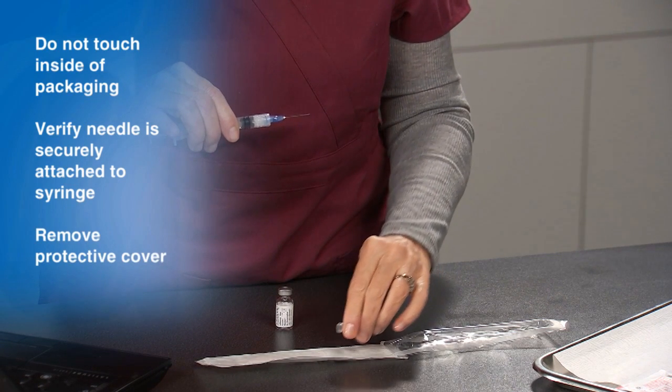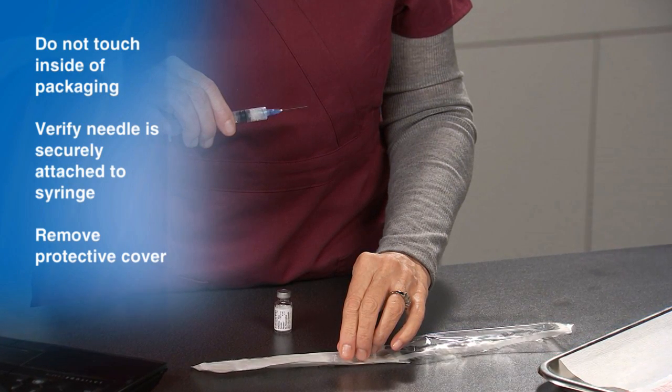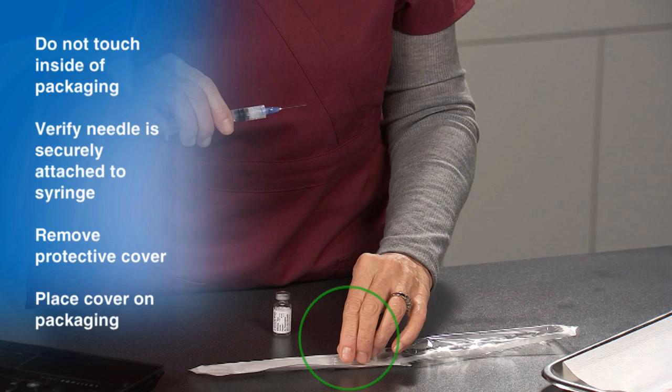Carefully remove the protective cover from the needle. Being careful not to touch the open end, place the needle cover back on the packaging.